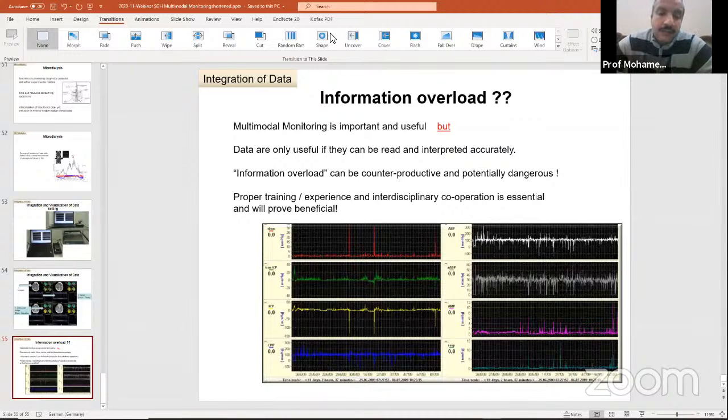So the non-invasive techniques like transcranial Doppler and calculated ICP parameters, I can use the mean arterial blood pressure and pulsatility index to detect the increase in ICP. And me personally in my practice, and I have published work on this, the transcranial Doppler and the estimated or calculated ICP is quite as effective as the direct invasive ICP measurements. My question for Dr. Jorn.